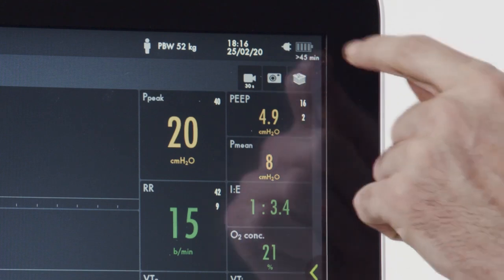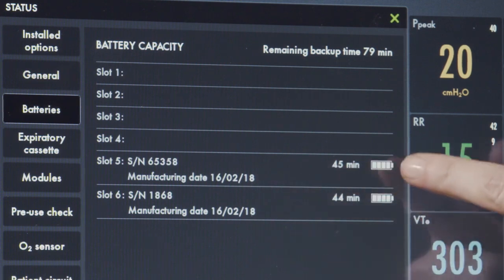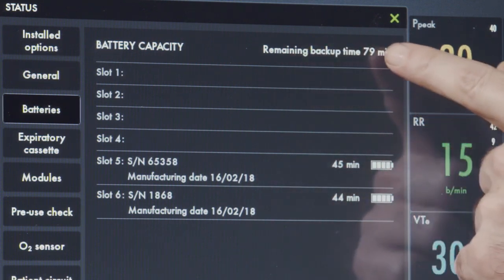On the upper right-hand corner of the screen is the power indicator. When pressed, you can see your battery status and the amount of time remaining on each battery, as well as a total backup time.